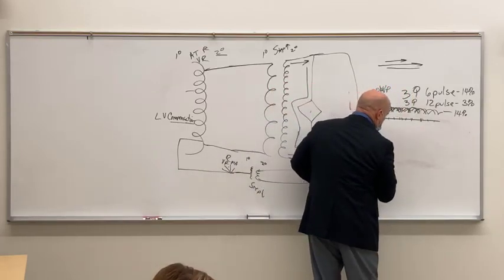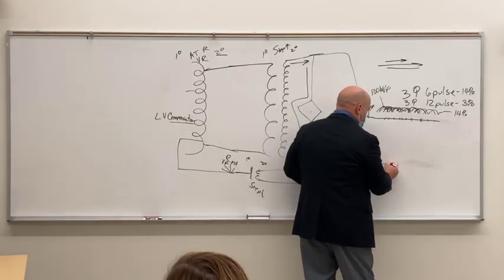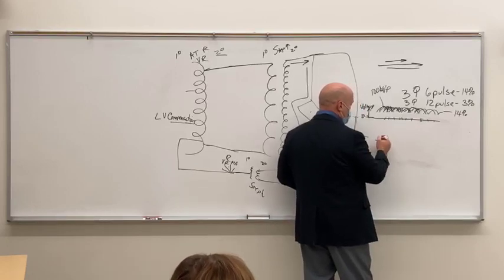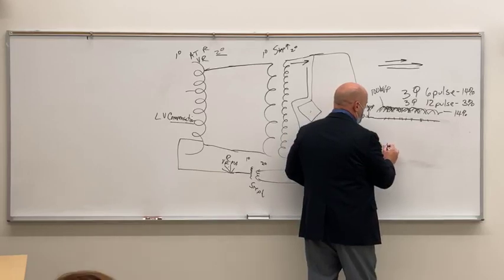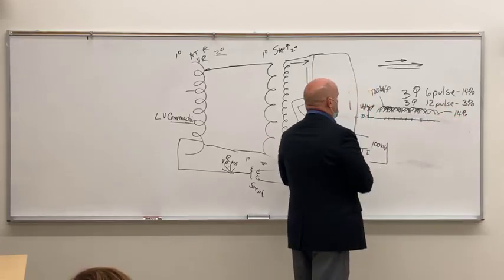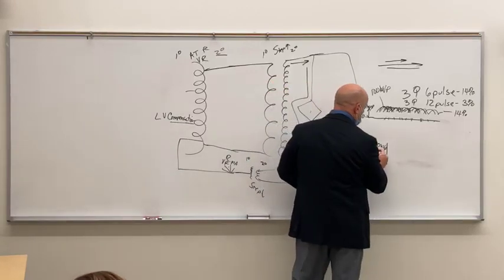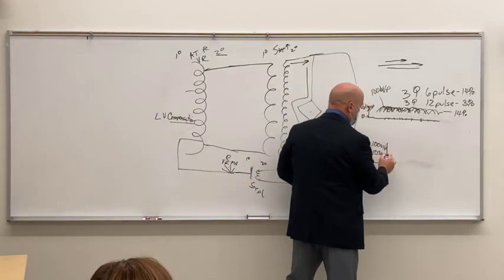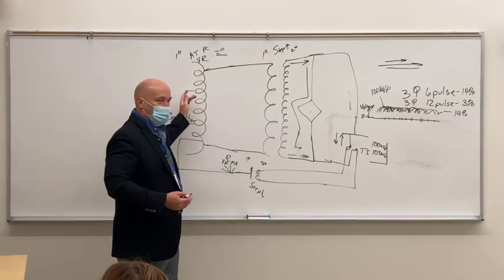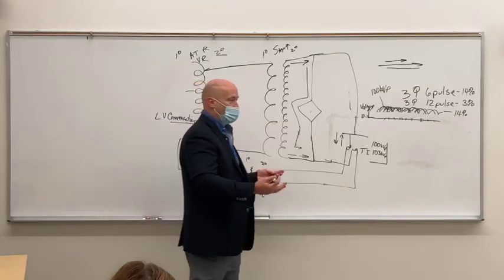Right, so when you make the exposure, you're at 0 voltage because you're on prep. You make your exposure, you send the electrons across the tube, and let's say you set 100 kVp. What's your voltage ripple on 3-phase 12-pulse? 3%. 3%, right. So you set 100 kVp. What the machine sets for you is something closer to 103 kVp. Okay? So even though you set 100 kVp over here, your machine is set to give you a greater output or a greater kVp.